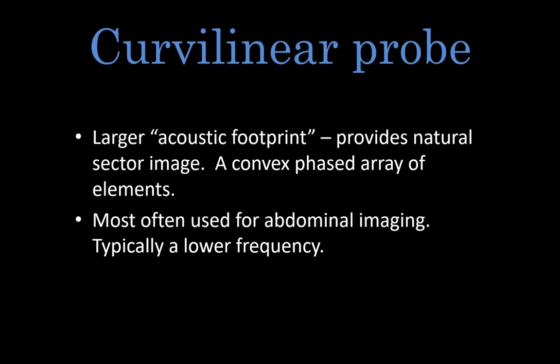The broad curved transducer of the curvilinear probe gives a natural fan or sector image.